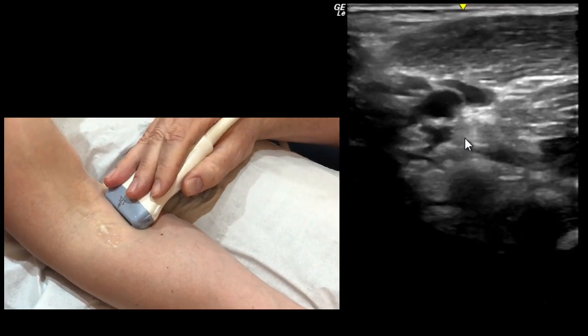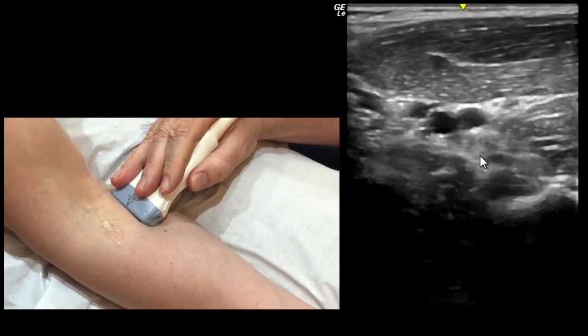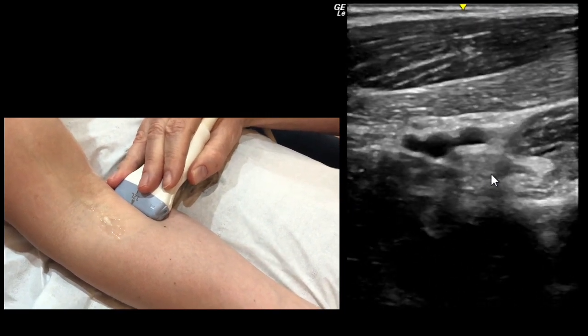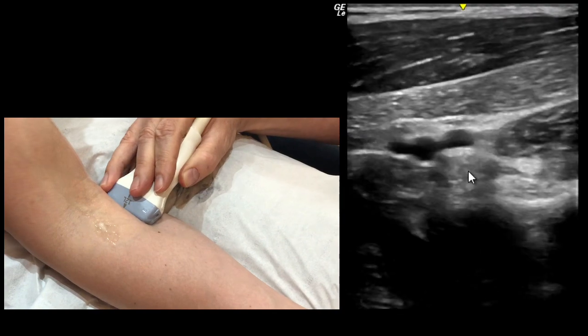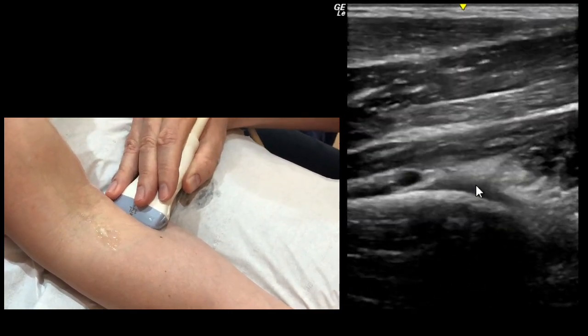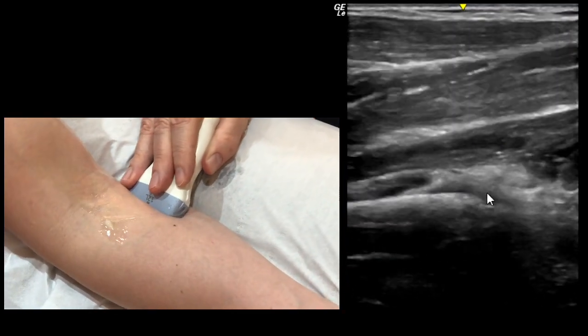You come down in the short axis all the way around until you see the tendon open out here, and it spreads out and has a broad insertion over the radial tubercle here.